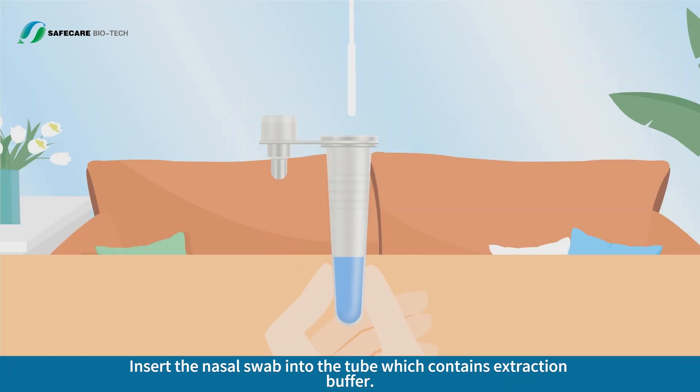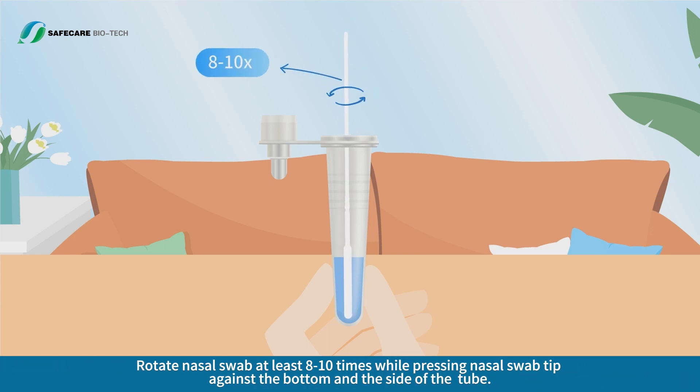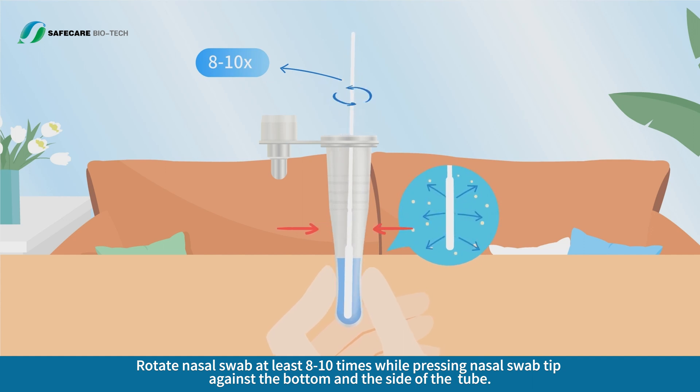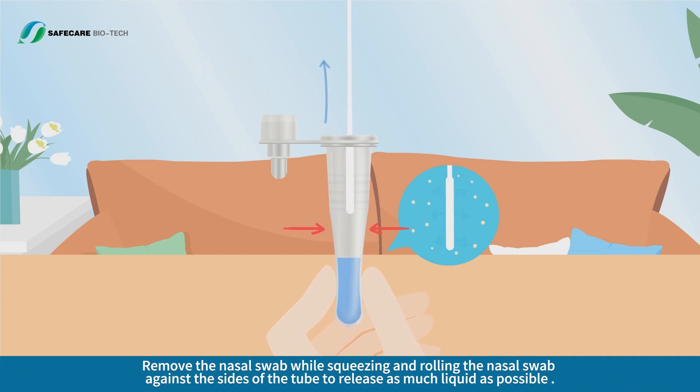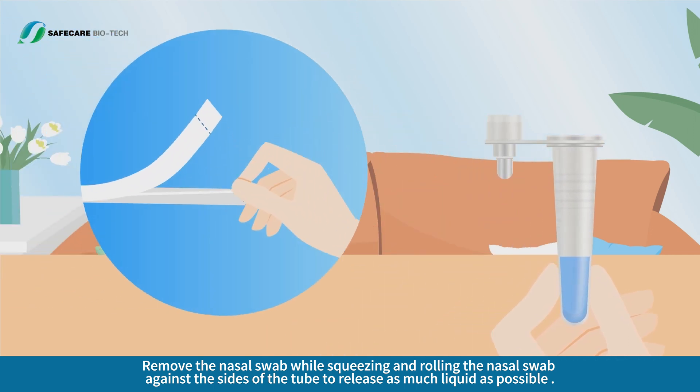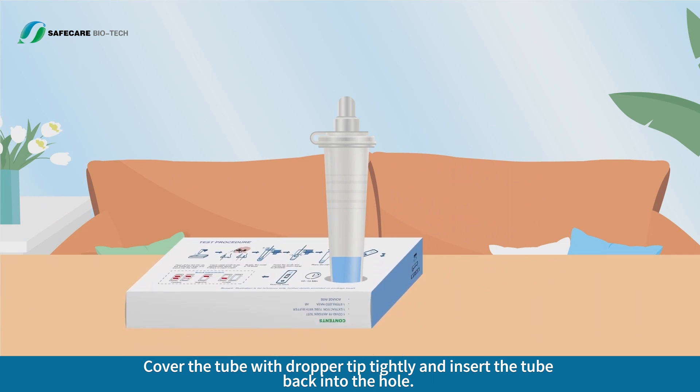Insert the nasal swab into the tube which contains extraction buffer. Rotate the nasal swab at least 8 to 10 times while pressing the swab tip against the bottom and sides of the tube. Remove the nasal swab while squeezing and rolling it against the sides of the tube to release as much liquid as possible. Cover the tube with the dropper tip tightly and insert the tube back into the hole.